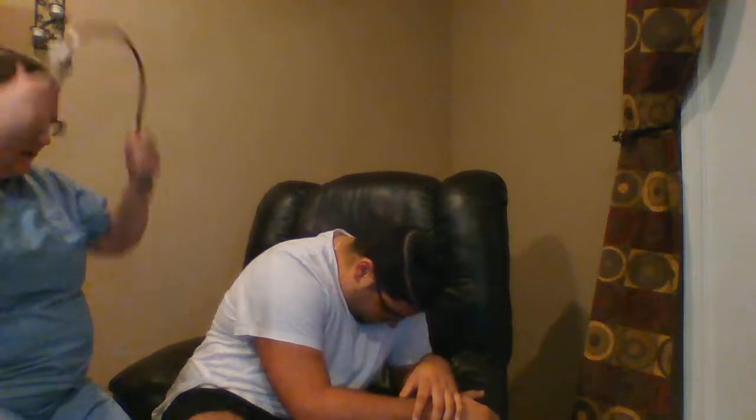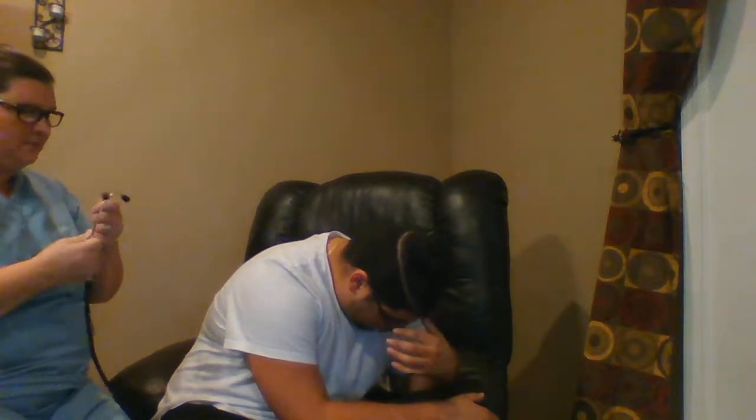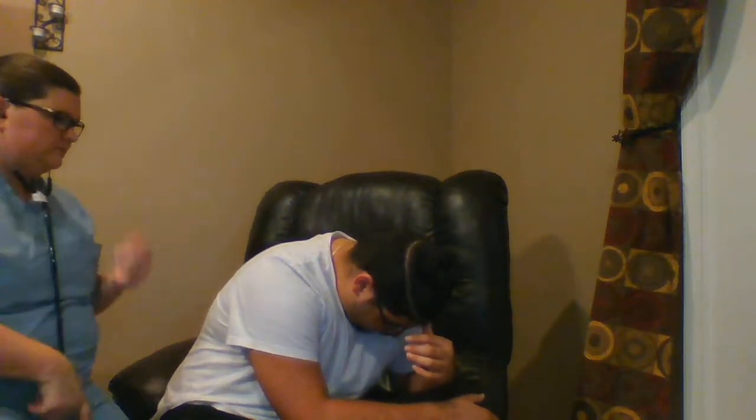Perfect. I'm again going to listen to you, just have you take some big deep breaths as I move my stethoscope.